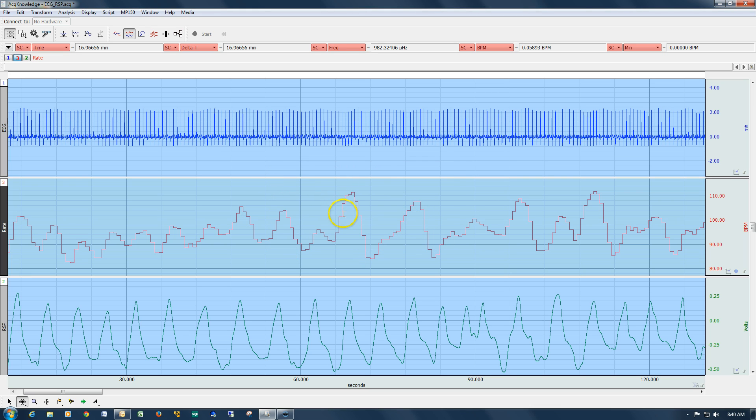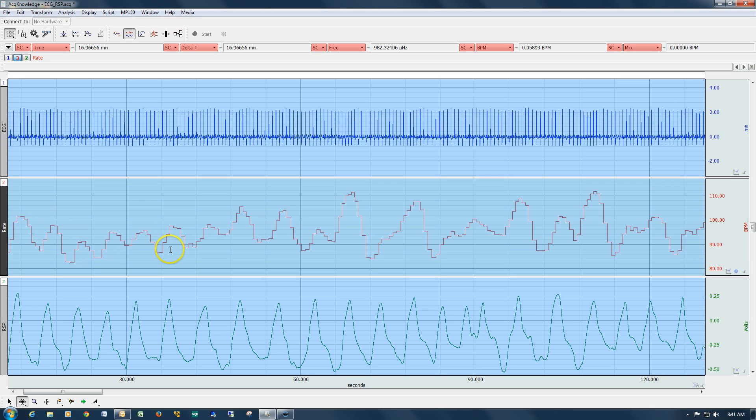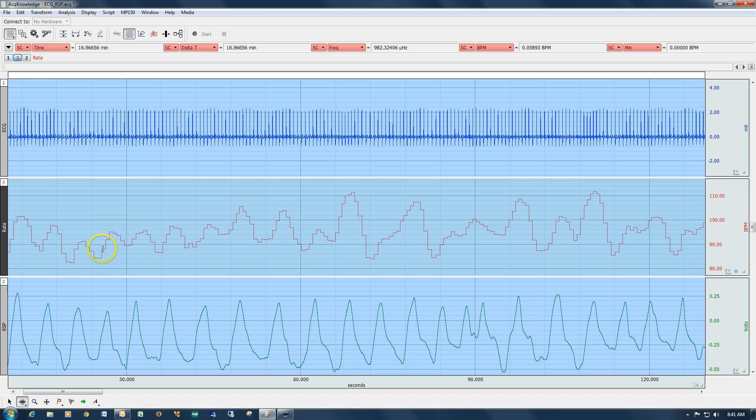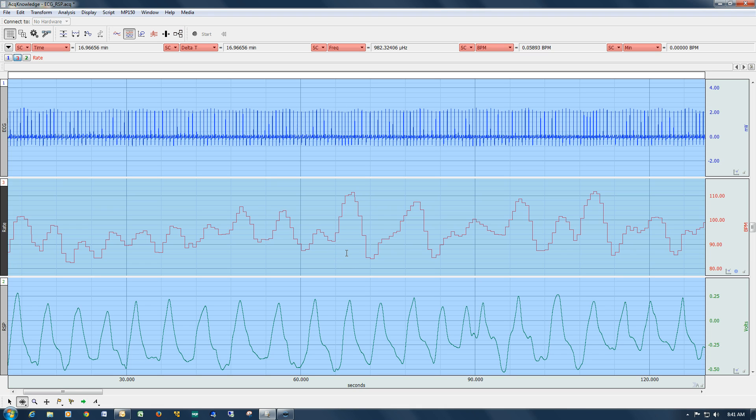In this file here we've got three channels. This is a typical recording. We've got ECG on channel one, heart rate immediately below that, and then respiration. As you can see, the way the heart rate channel is calculated, it's basically a tachogram and there are discrete values for the heart rate at any given point in time. So you end up with this stair-step effect instead of a smooth waveform moving up and down as the subject's heart rate is changing over time.